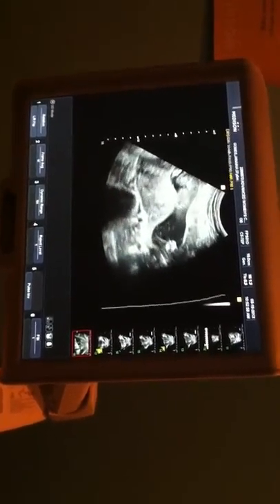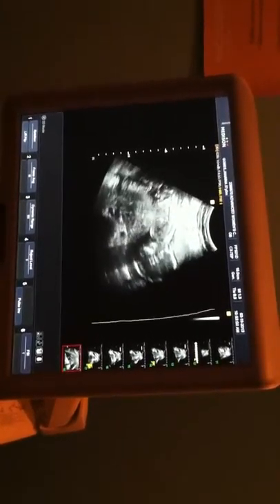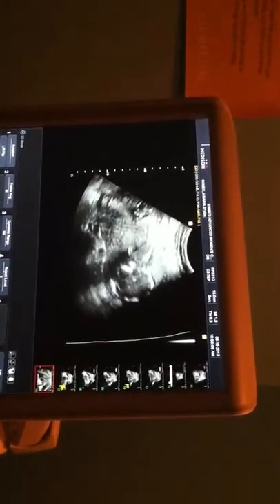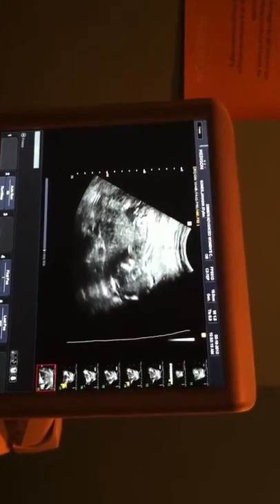Tapping his little feet there. Put a little arm over his head there, pulled back like that.